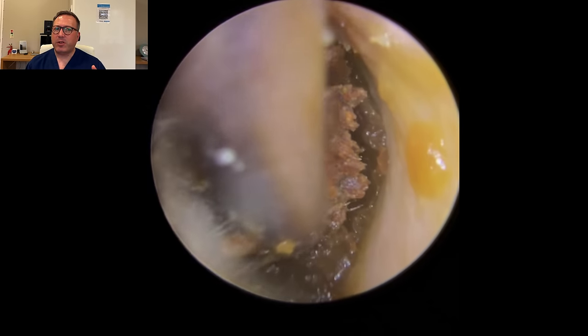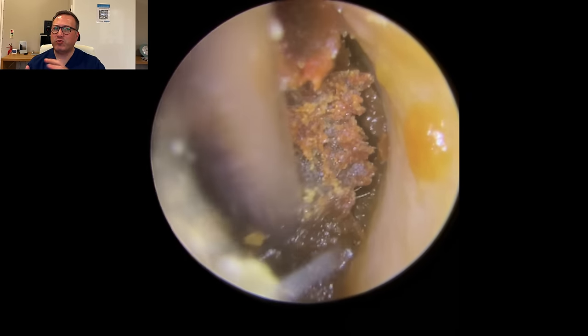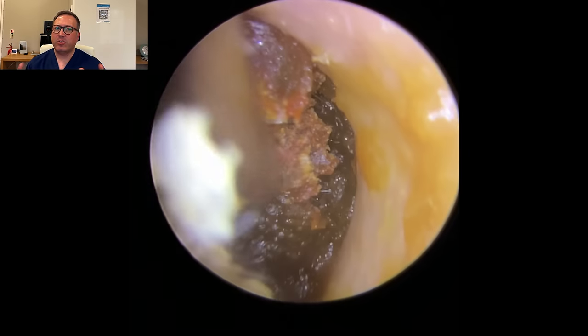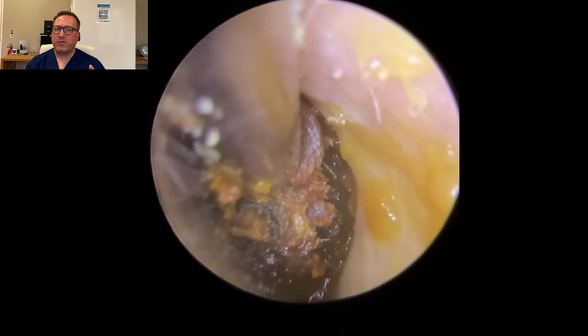You can see we're just trying to pull it off this left canal wall at the moment. You can see the different natures of it - see how much more dry and crumbly this edge is as we pull it across here. So we should be getting a good grip, and you can see there's a lot of good movement to the wax there. We're getting this really good backwards and forwards movement.